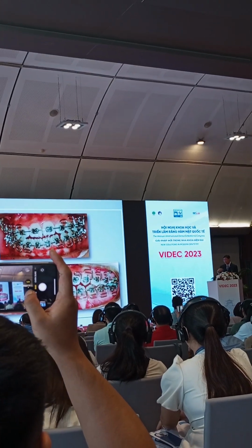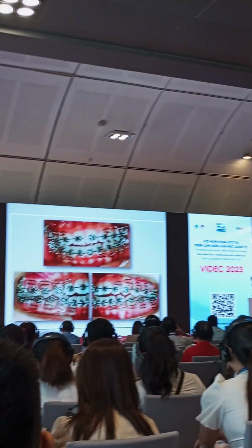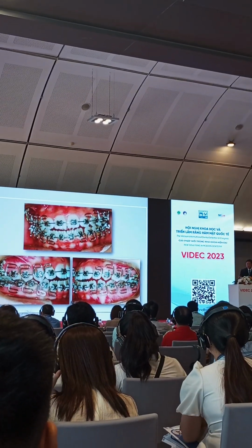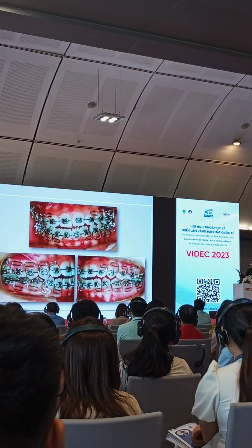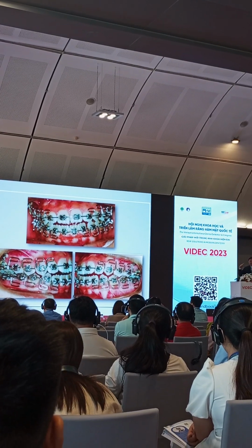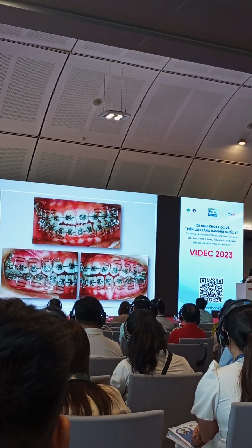So that is my main goal, to close the bite, and then I will just deal with the cross bite on the molar later, by correcting with the use of the wire. So it would be better that you place something also on the lingual to intrude the molar without any side effect on the molar.